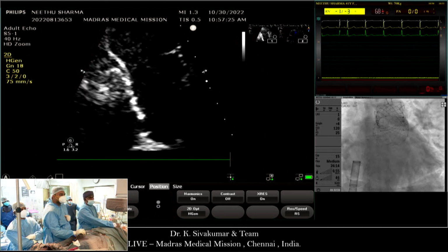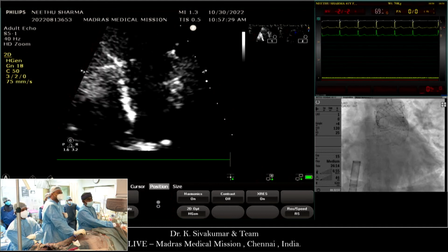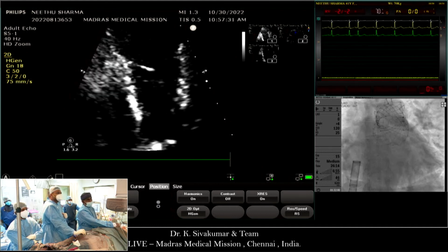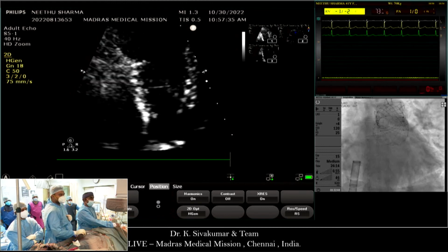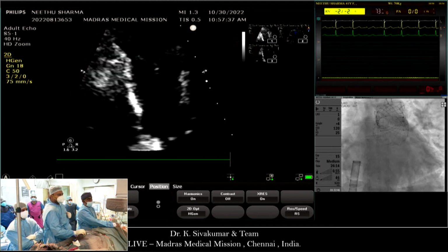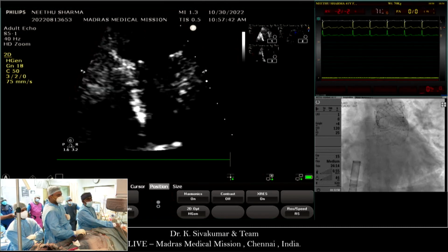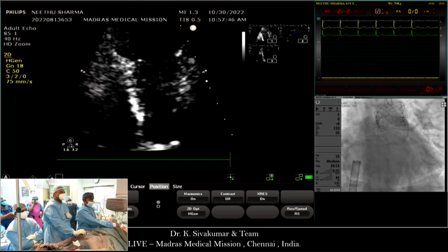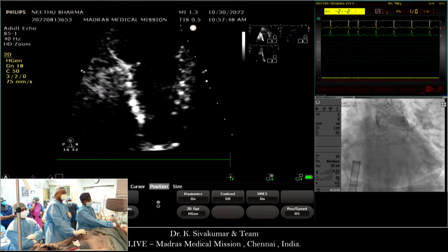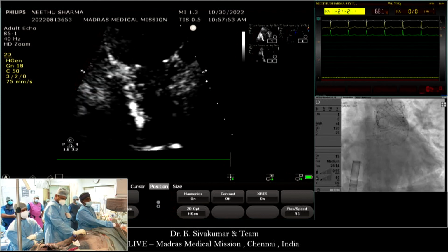Two of our patients discontinued aspirin and clopidogrel. Our protocol is lifelong dual antiplatelets with aspirin and Plavix. However, a couple of patients stopped them, and on a routine surveillance CT at the end of 4 years, we found some leaflet thickening on the basal part of the valve on the pulmonary side, at the nadir of the sinuses.